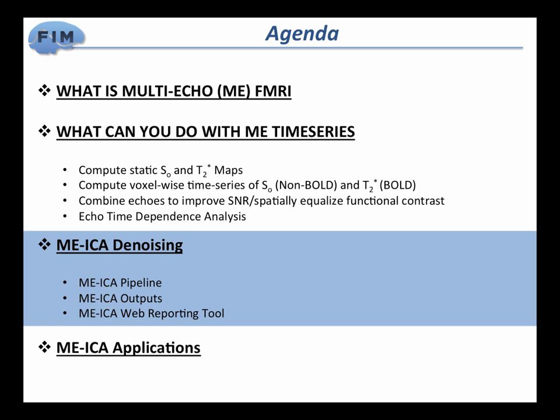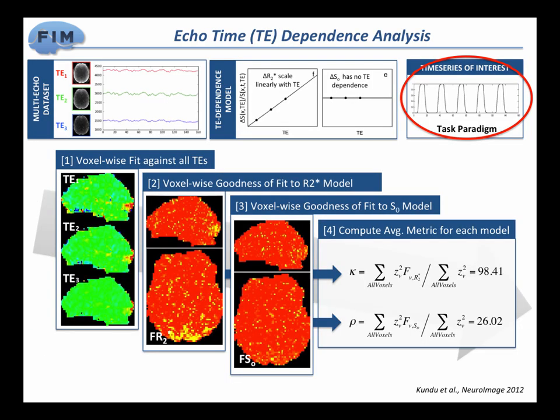I've been asked how strong the assumption of linearity is. Those models are true as models. The problem is that in your data, whatever signal you're going to be testing, most likely it's still a combination of things. For example, in a second I'm going to explain MEICA. We're going to do an ICA decomposition and come up with a series of signals for which we're going to test whether they fit one of these models or the other.